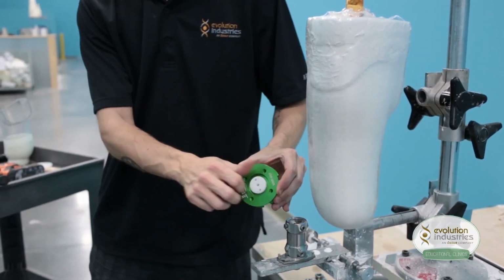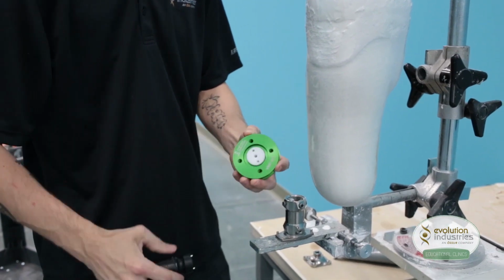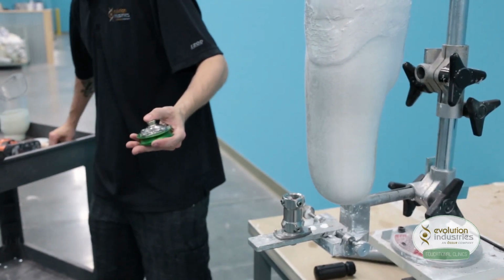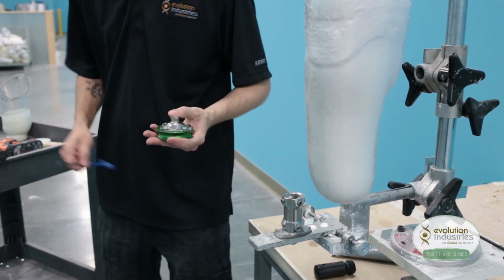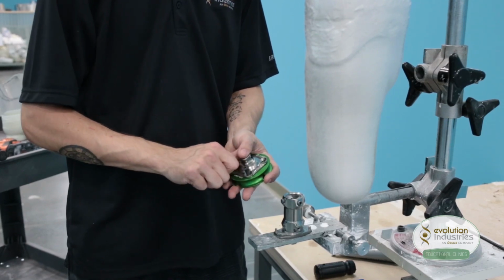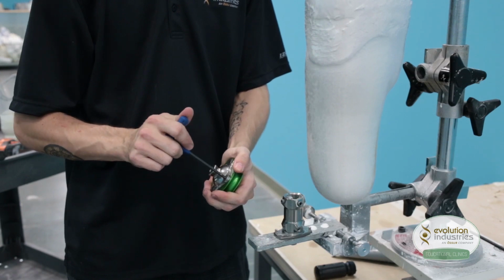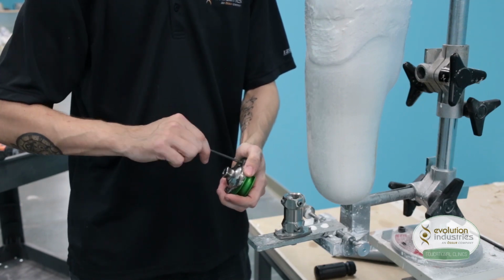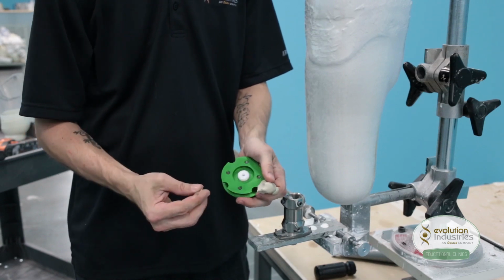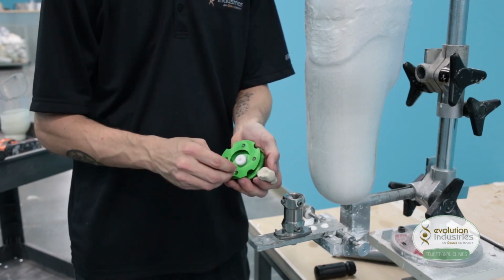So you want to screw it in clockwise. Tighten it down with the wrench tool so it's nice and flat with the bottom surface of the plate, the labeled surface. We add our pyramid and 4 set screws. And on the back side of the plate, we'll first fill the center hole of the valve dummy with some plumber's putty, making a nice flat surface, and then we will cover the back side of all 4 screws.